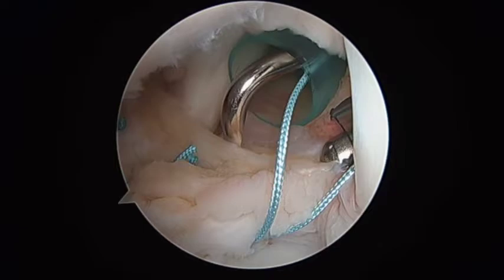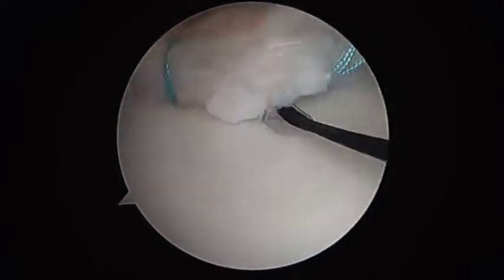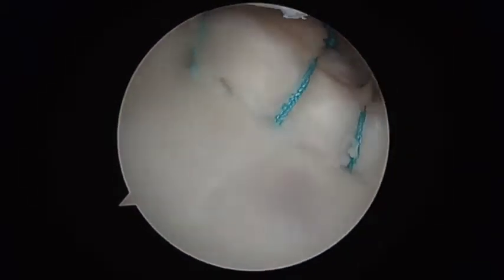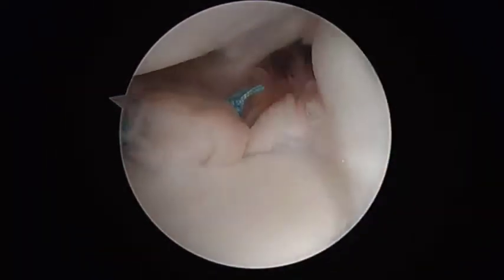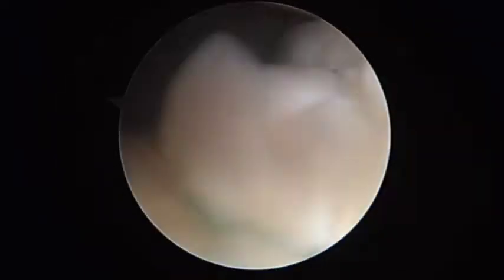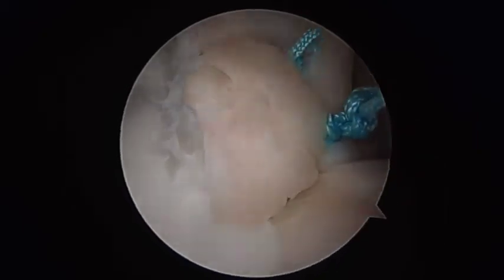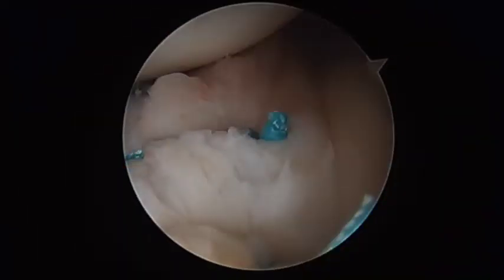Note that as the final anchors are being placed superiorly on the glenoid, the middle glenohumeral ligament is nicely retensioned to provide stability to the joint. Now that the defect is all repaired, we can see that the IGHL and MGHL were also retensioned. Therefore, the capsular tear was also addressed while the labrum was repaired. Postoperatively, the patient was placed into an ultrasling with instructions to avoid combined external rotation and abduction.